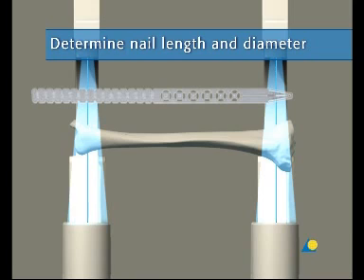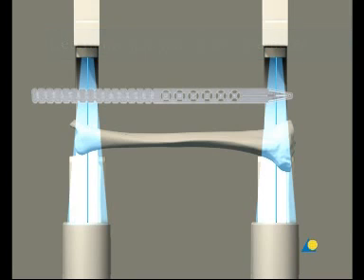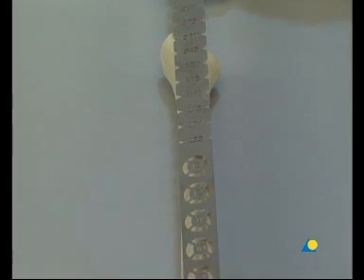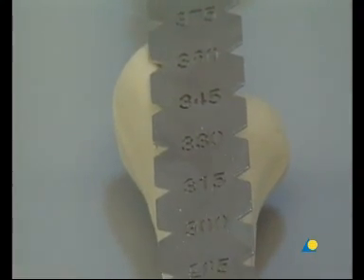The required nail length must be determined after reduction of the fracture. The image intensifier is positioned for an AP or lateral x-ray of the proximal tibia. Using long forceps, the radiographic ruler is held parallel to the tibia on the lateral side of the lower leg. The ruler is placed so that its distal end is level with the required nail insertion point. The skin is marked on the lateral side. The image intensifier is moved towards the distal end of the tibia. The proximal end of the radiographic ruler is aligned with the skin marking, and an x-ray of the distal tibia is taken. The reduction is verified, and the required nail length is read from the radiographic ruler as it appears in the x-ray.